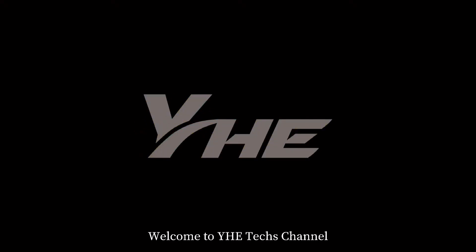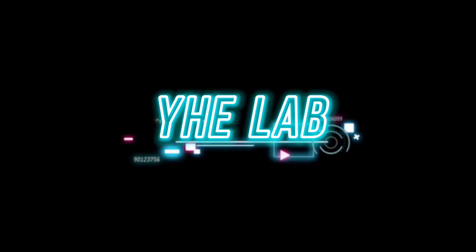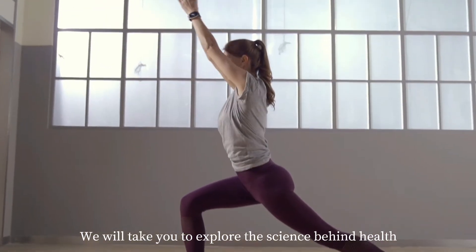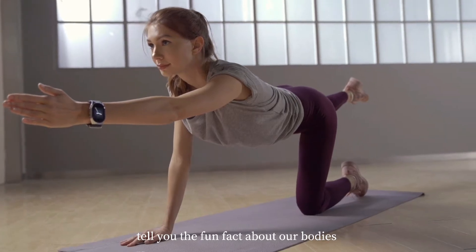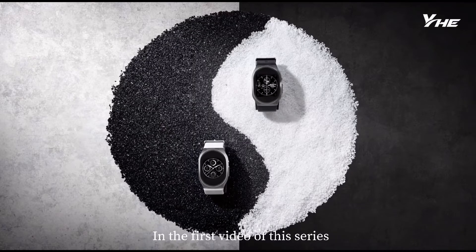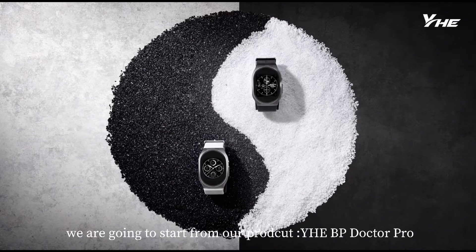Welcome to YHE Techs Channel. This is our new series, YHELab. We will take you to explore the science behind health and tell you the fun facts about our bodies. In the first video of this series, we are going to start from our product, YHE BP Doctor Pro.